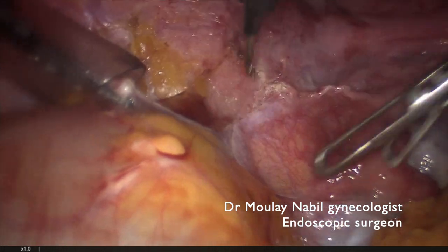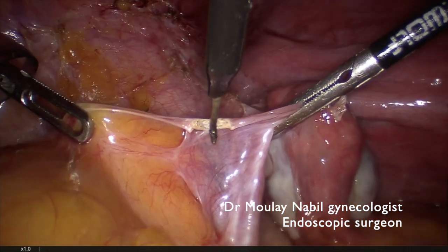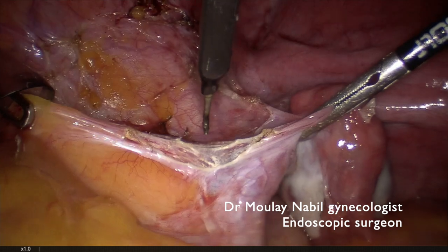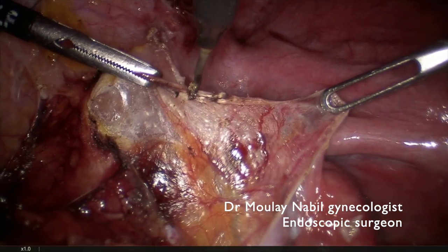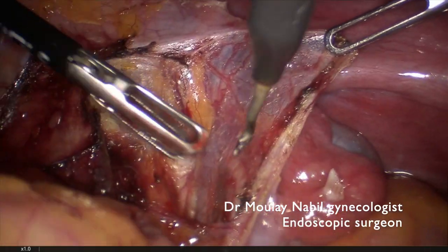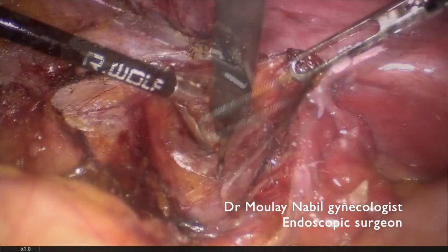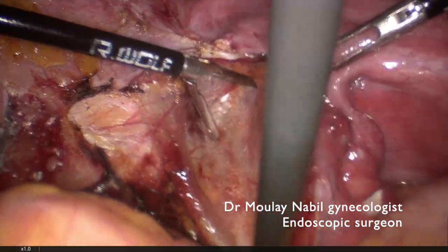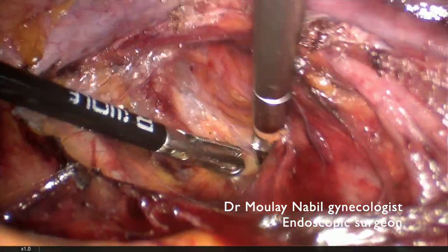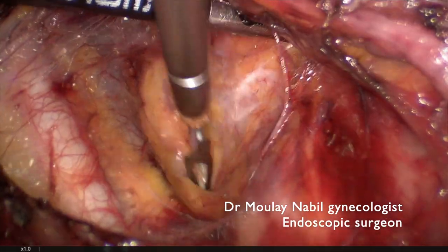Due to the cervico-isthmic position of this myoma and for better vascular control, we prefer to control both internal iliac arteries rather than the uterine artery. If you control the uterine artery at its origin, you have good control on the uterine corpus but poor control at the cervico-isthmic level. For this reason, in this huge myoma with cervico-isthmic position, we prefer to control the internal iliac artery.